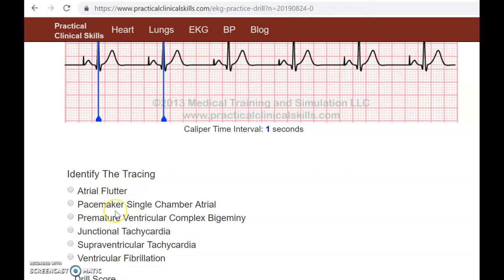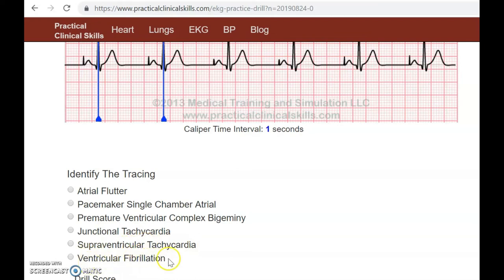So let's look at our choices — it's not a flutter. Pacemaker? Definitely yes, single chamber atrial — we'll go with that. It's not a PVC. It's not junctional because we do have our P waves. It's not SVT because SVT is a very very fast rhythm and you can't really see the P waves with SVT. It's not V-fib because nothing is shaking and we have defined PR intervals. So we're going to go with pacemaker.